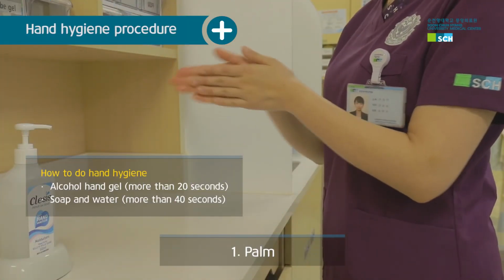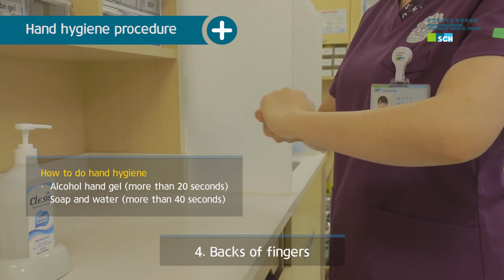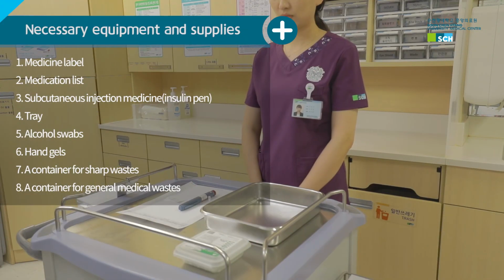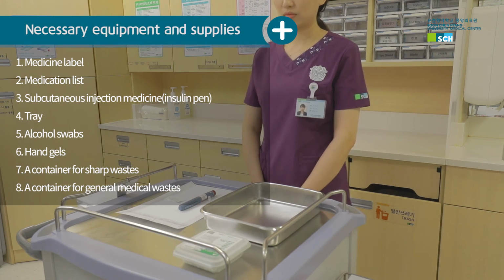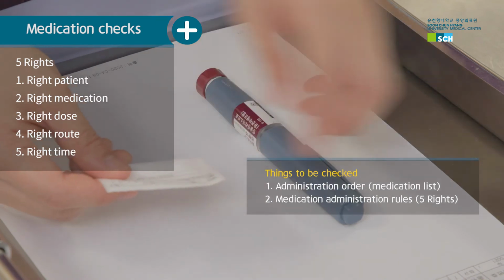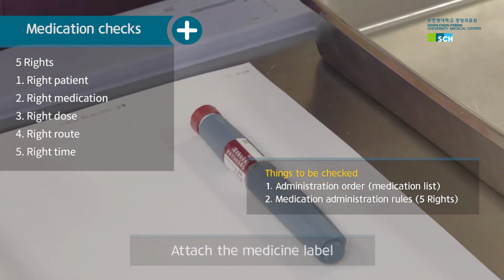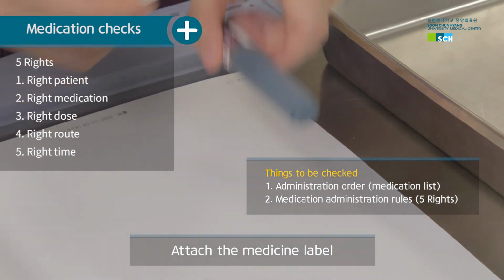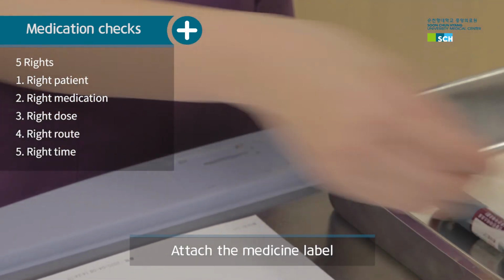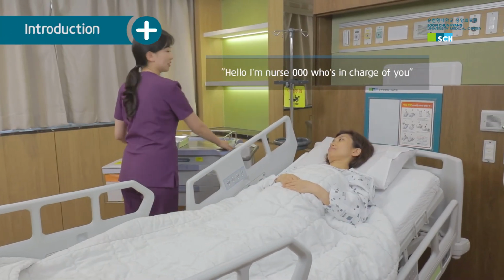Before preparing equipment, perform hand hygiene with hand sanitizer for at least 20 seconds until your hands are completely dry. Prepare necessary equipment and supplies. Check the medication list and the medicine label accurately and attach the medicine label to the medicine. Go to the patient with prepared equipment.